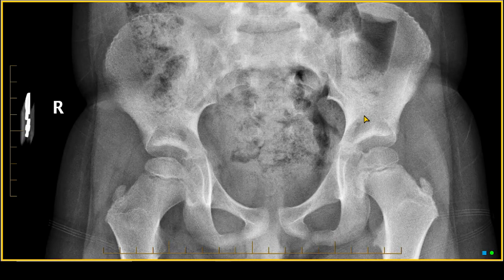Let's move on to the hip. This is a six-year-old boy with right hip pain. Here's a radiograph in the frontal projection. Let's look at what we can see.